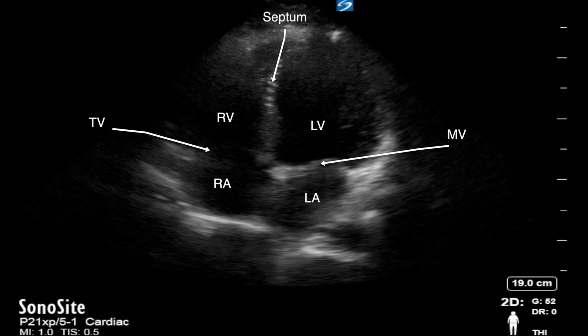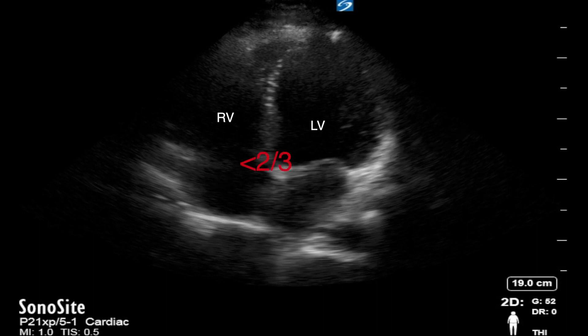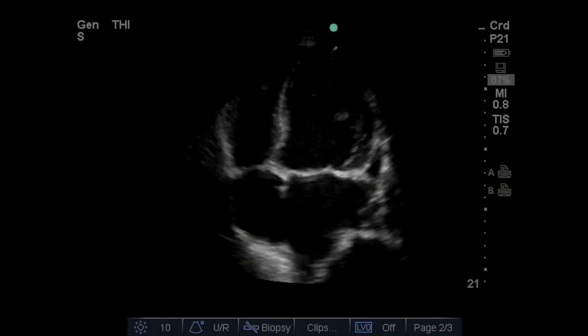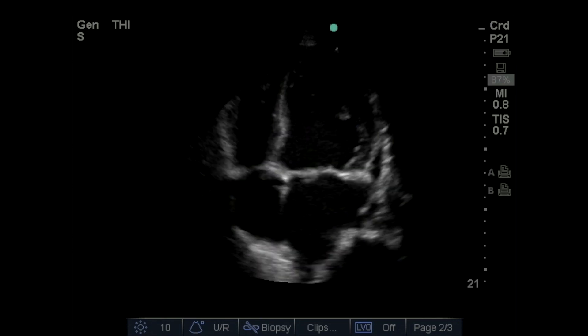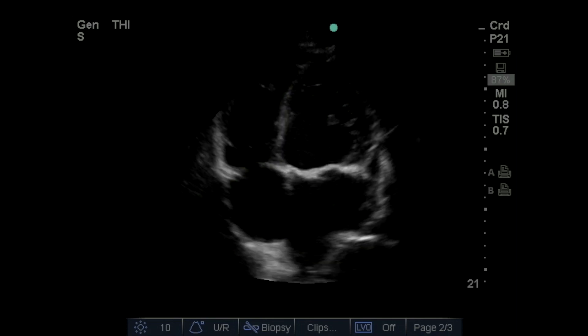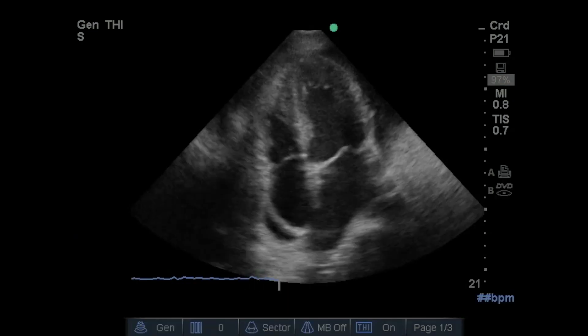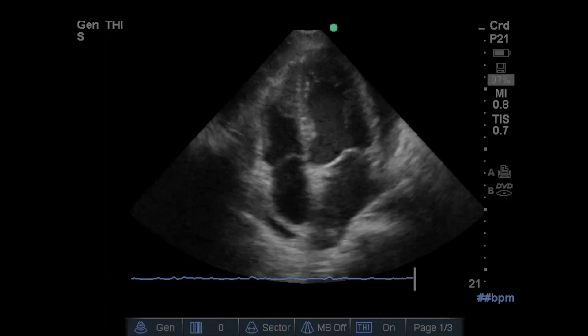Here you can see a still shot of an apical four-chamber view with visualized structures labeled. The apical four-chamber view offers a tremendous amount of clinical information. On a simple assessment, this view allows comparison of RV size to LV size; this ratio should typically be less than two-thirds of the LV size in a normal individual. Here are several clips of abnormalities, including left ventricular dysfunction and pericardial effusion without tamponade physiology.